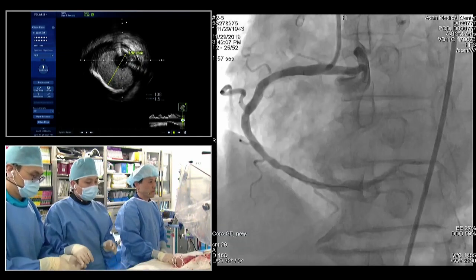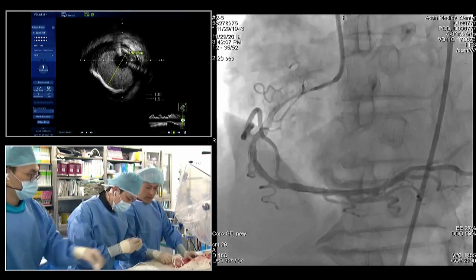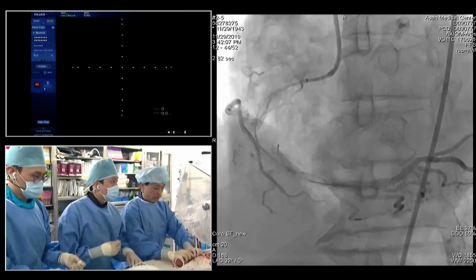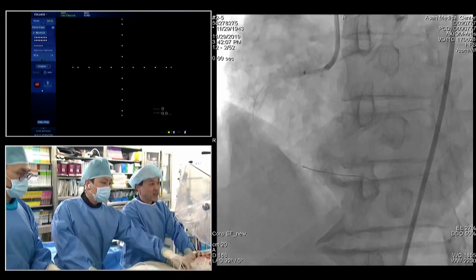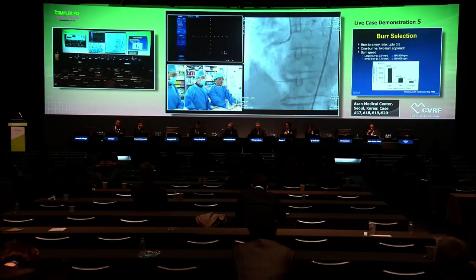Very nice, yes. All right, I think we'll IVUS now. Any other thoughts? Let me take the guideline. Okay, Michael, you want to be back in the after the introduction of the second lab here, right? Okay. Great. And we'll show you the IVUS afterwards.